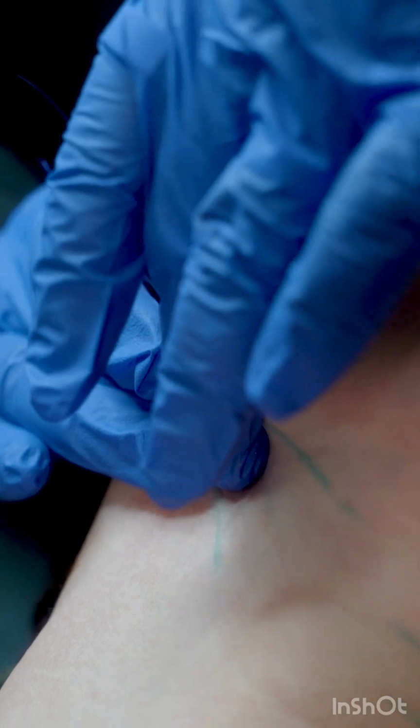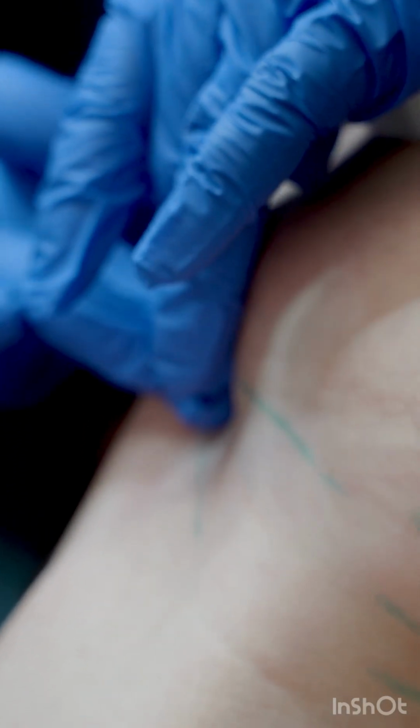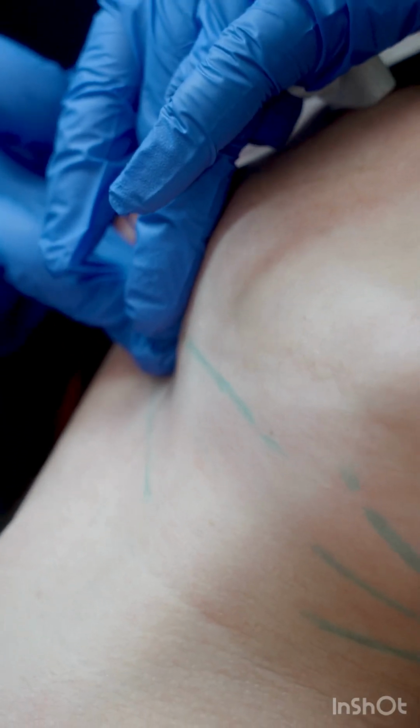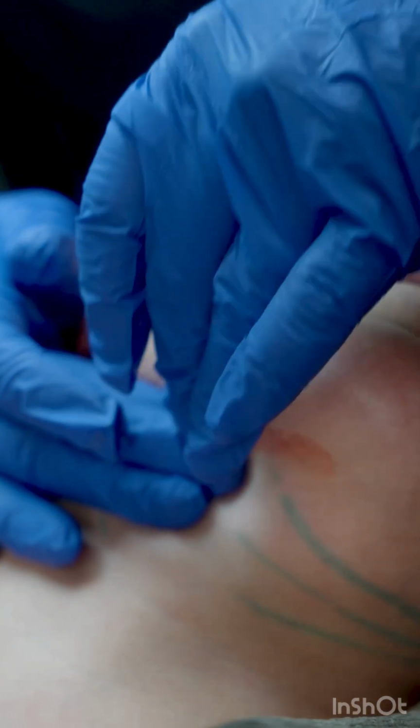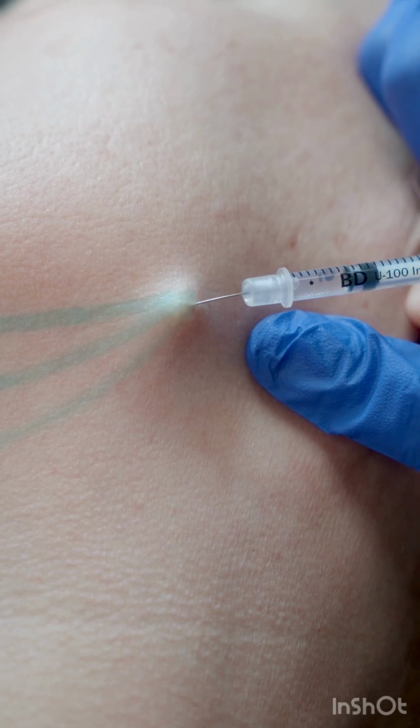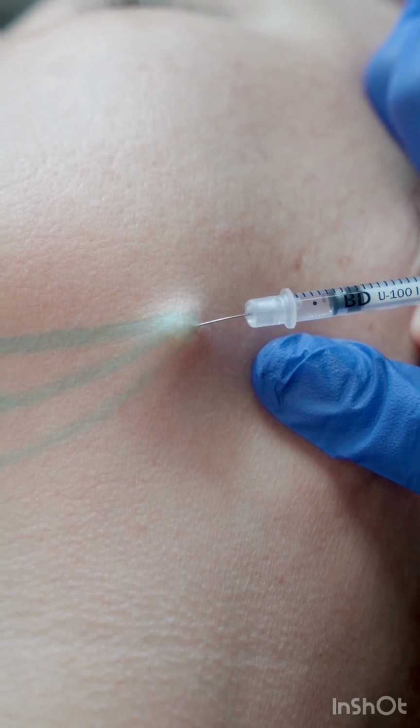I then engage the threads with my fingertips to ensure that all the barbs catch the tissues underneath. This will help to hold her lift in place. I like to do this a few times to ensure that they are locked in.